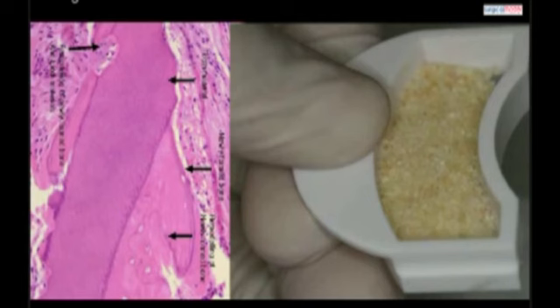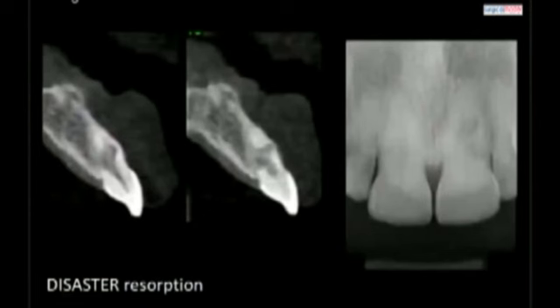And if you think about each and every particle, let's say a few hundred particles, all being ankylosed into the socket, you're getting the most stable bone graft and the better quality. And in my experience now, using it now for a few months, I'm getting great implant sites with very good stability. Now, you can also use it for immediate placement. That's my bone graft of choice, and I explained why.